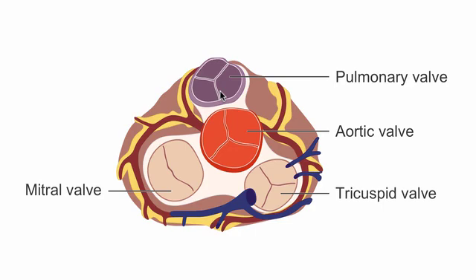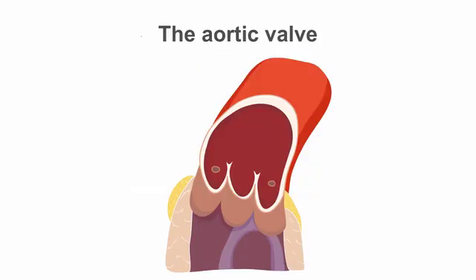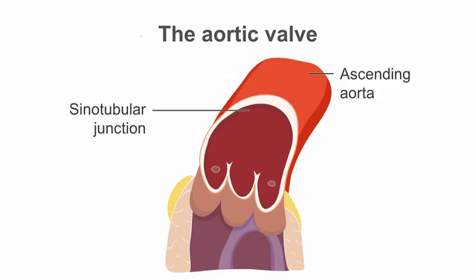Let us now take a look at the aortic valve and aortic root a little closer. From this image we can see the various structures that form the aortic valve complex. The ascending aorta lies above the sinotubular junction, which forms the boundary between the ascending aorta and the aortic root.